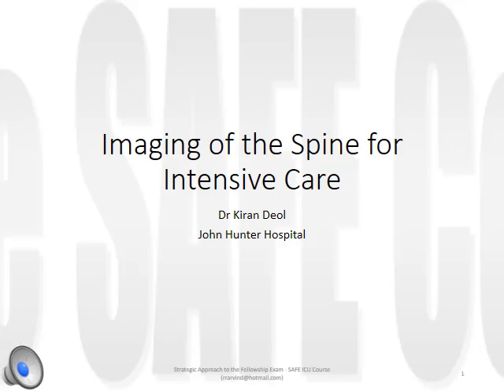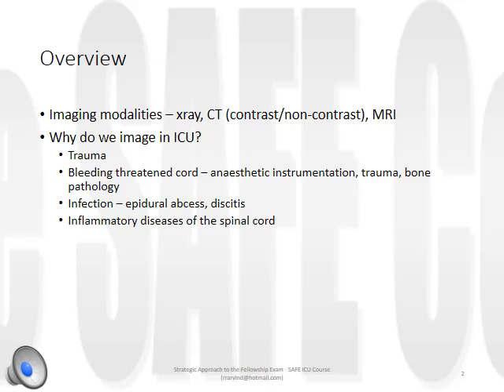We're going to be talking about imaging of the spine for intensive care. We're going to be discussing several modalities, including X-ray, CT with and without contrast, and MRI with and without contrast. We'll consider why we image in intensive care.